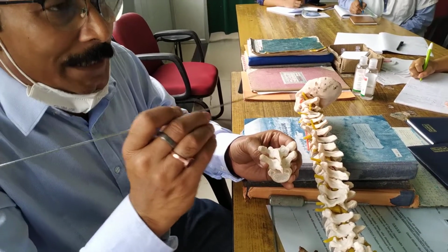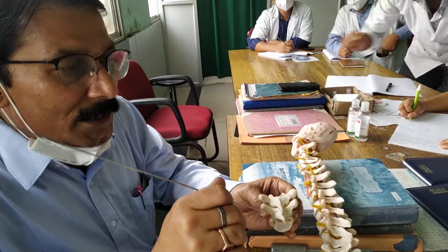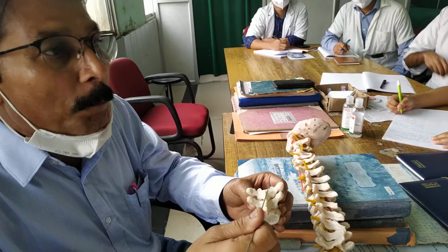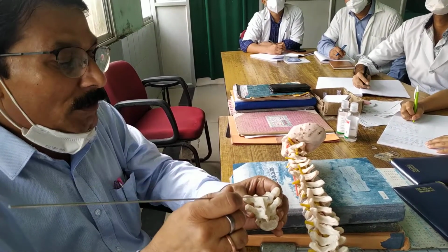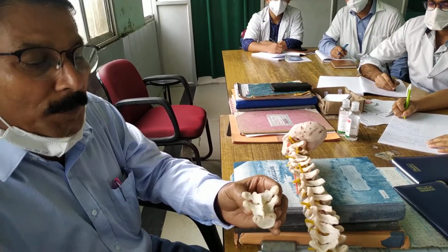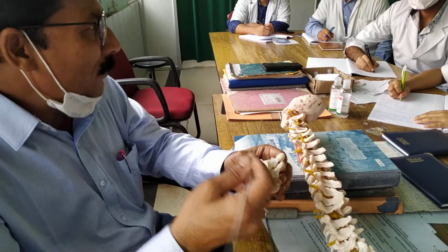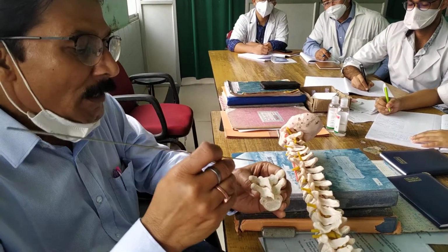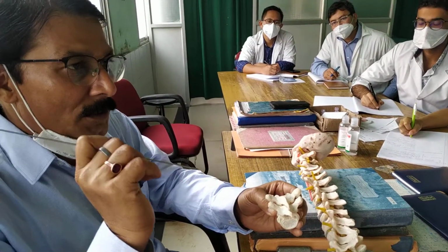As I said, the technique of doing these dissections of the muscles is always subperiosteal. Do not try to do dissection through the muscle. So once your patient is in the prone position, you make the incision in the midline. Go to the midline raphe, which is more or less avascular.